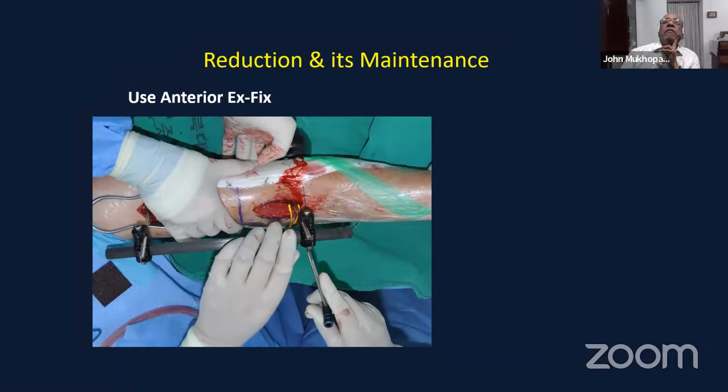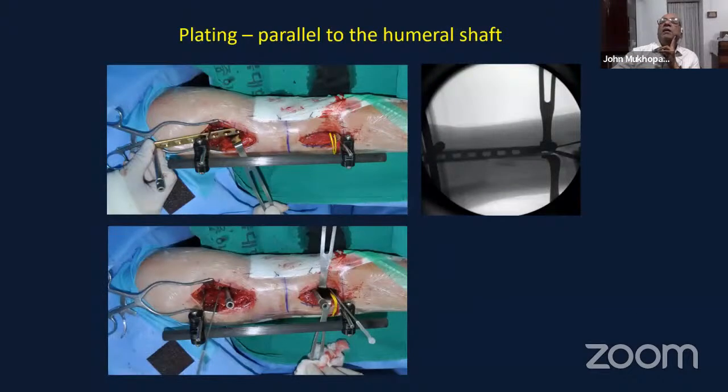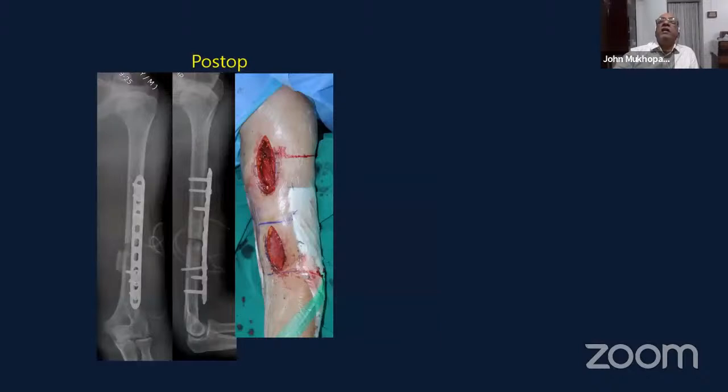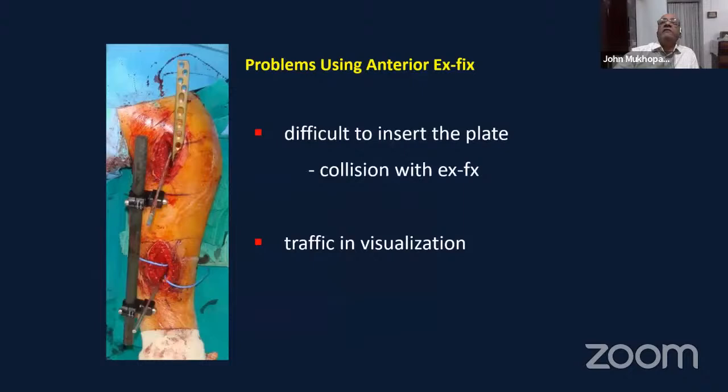So how the various tips and tricks, you can use an anterior external fixator and then try and slide the plate just lateral to your fixator so that you can still put it on the anterior surface. You can check your alignment on both views. So get your X-ray to turn around so that you're not rotating the arm when you're trying to get your images till you've got some fixation done. And this is a case from Dr. Oh again, where you can see how with minimally invasive fixation, it's gone on to heal satisfactorily.